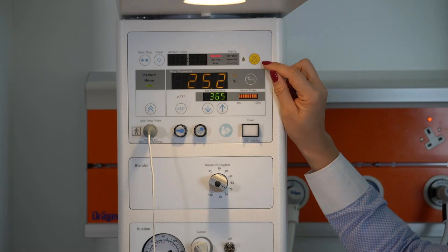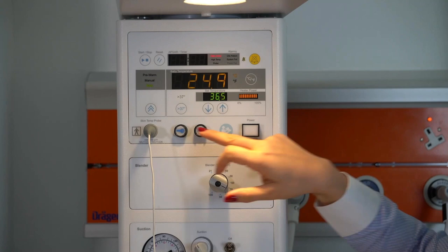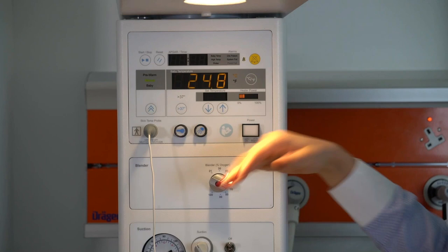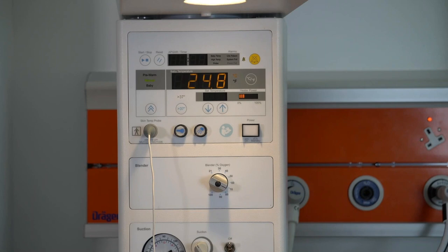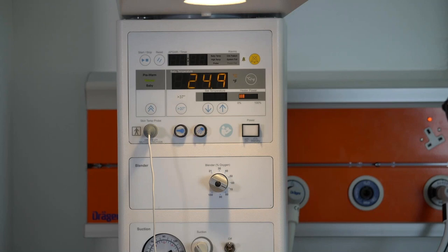And you can use Resuscitaire as an open care warmer by just using these controls. You can basically start with the manual mode, start your operation while you're connecting. If the baby is not critical and does not require resuscitation, you can connect the temperature probe and start the manual mode. And then once the temperature probe is connected, you can switch into the baby mode and leave the baby to provide a little bit of thermal support while the baby is then transferred to the mother. So there is a possibility for that.